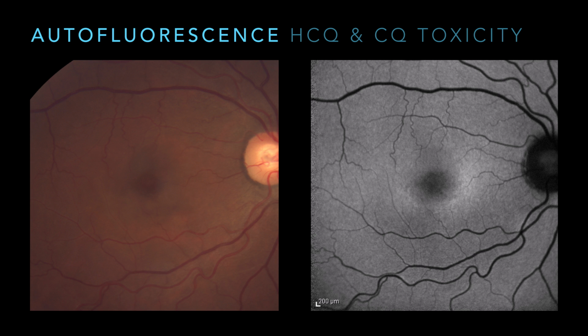So what we've done is we typically take multifocal ERGs on patients who have just started Plaquenil or who have been on it, depending on at what point in their treatment they come to see us. And we've had some patients where, because we have the luxury of, in the meantime, having somebody who can do it for us. My experience is that I've had some patients that have abnormal multifocal ERGs from the get-go. They've been on it for just a little bit. And so I recommend that they not even continue, even if they've just been on it for a couple of weeks or a couple of months, because I personally feel like that puts them at a higher risk.